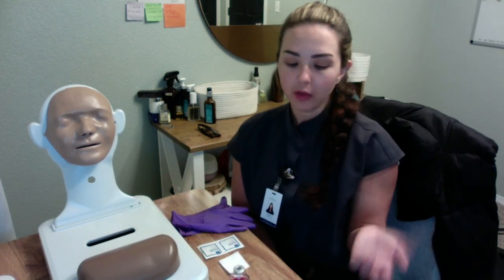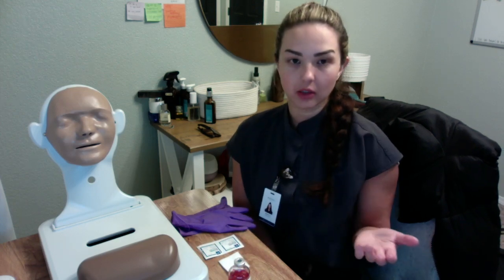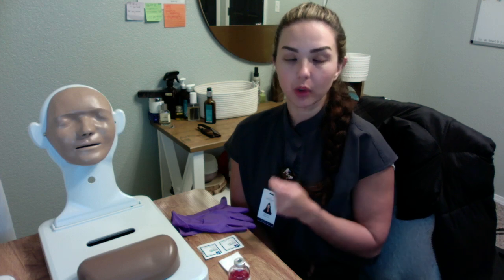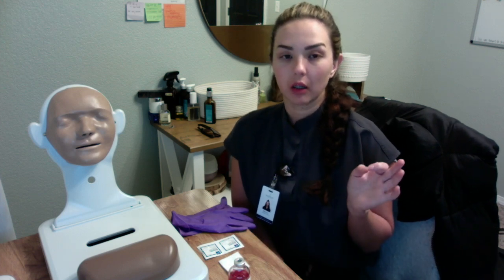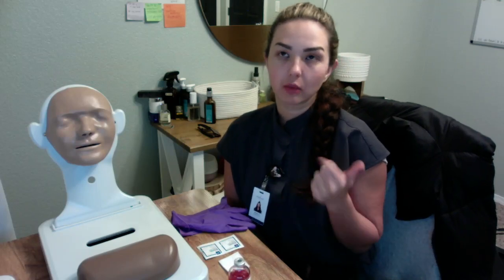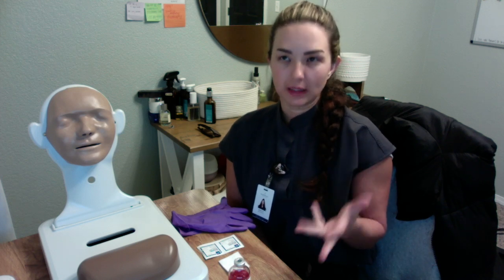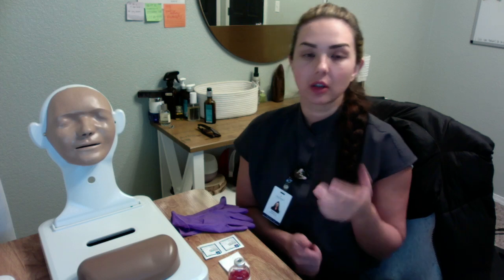So the first thing we want to do is collect our supplies, verify the prescriber's order, and then we want to move into our 6 rights of medication administration. So right patient, right drug, right dose, right time, right route, and documentation.